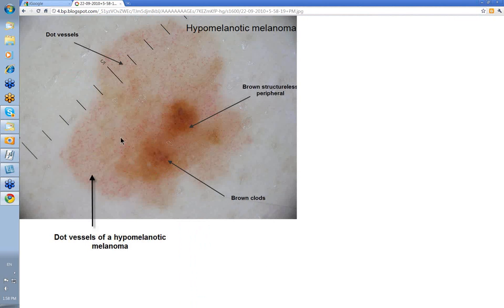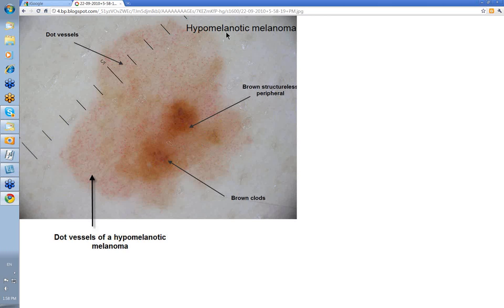Here you can have these dot vessels — lots of dots. Remember I said dots could be a feature of melanoma or nevus. You've got a sort of brown structureless area here, some brown clods in here. And this was a hypomelanotic melanoma, so the dot vessels helped you in making your diagnosis.